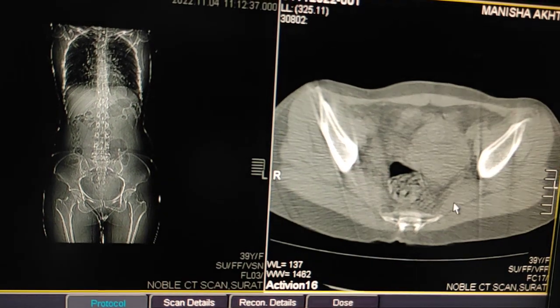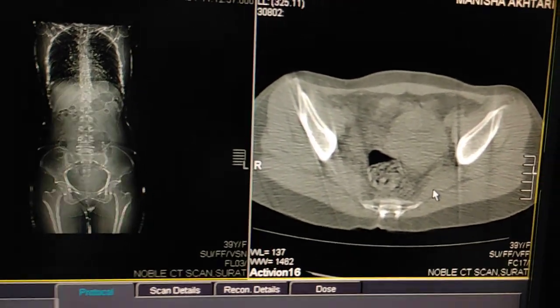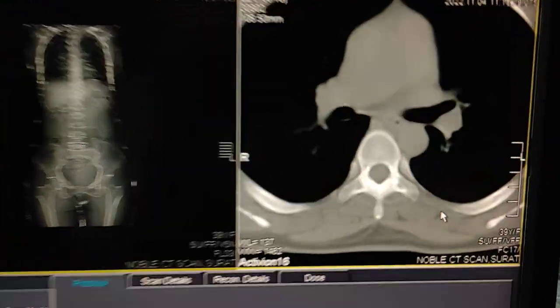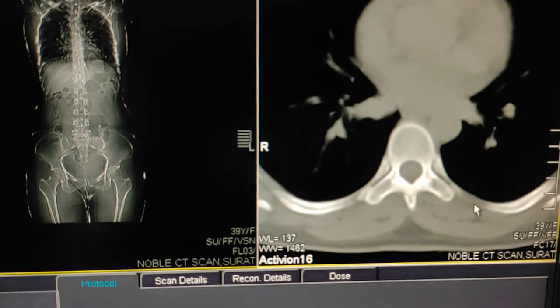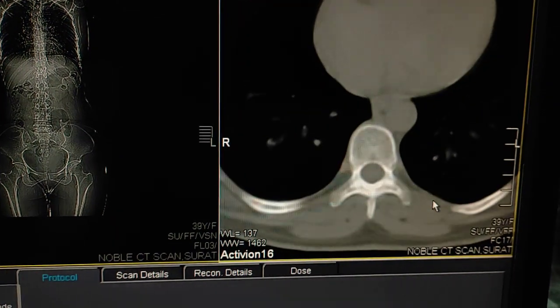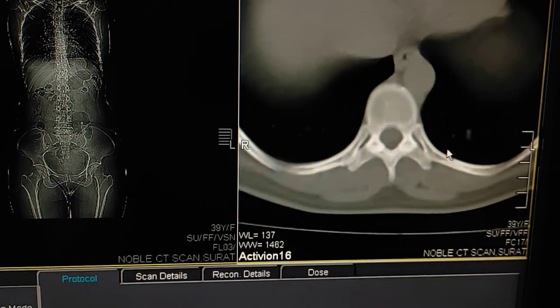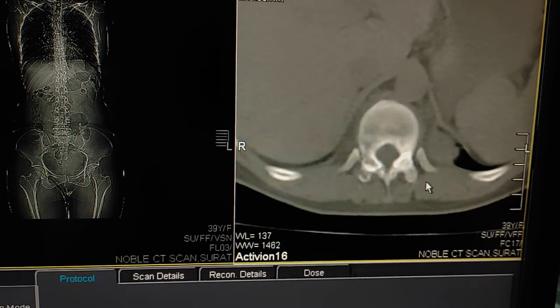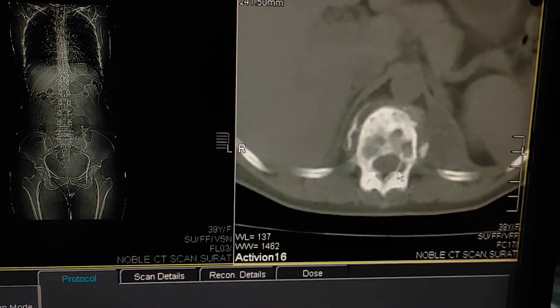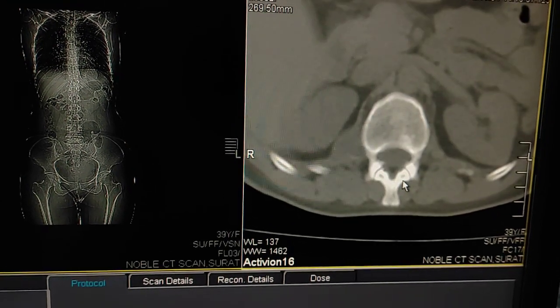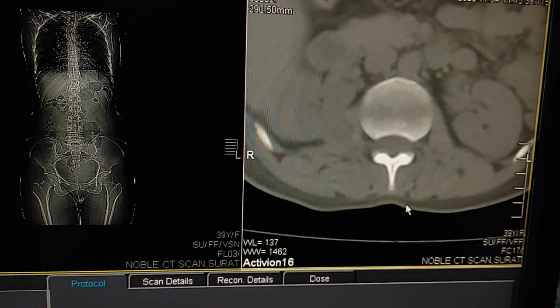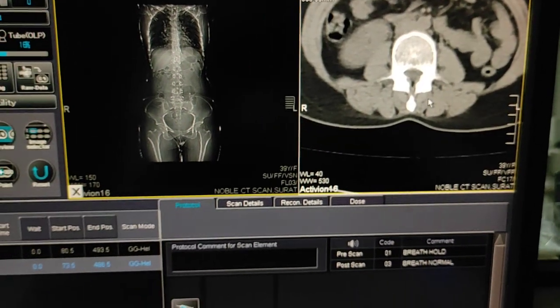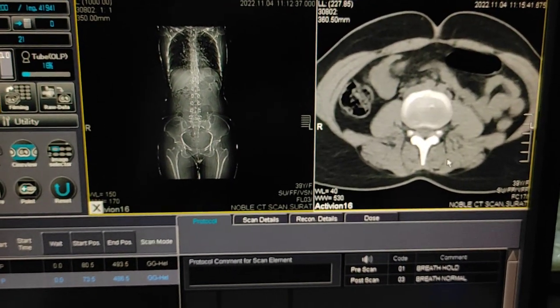Recons are important for filming purpose. The scan itself is very easy, there is no issue with the scan. Now the recons are important for filming, 3D, and all. Here you can see the images — these are thick and smooth images, like in abdomen soft tissue protocol. Here you can see the vertebrae; there is destruction in the vertebrae, there is soft tissue involvement. It might be Koch's.